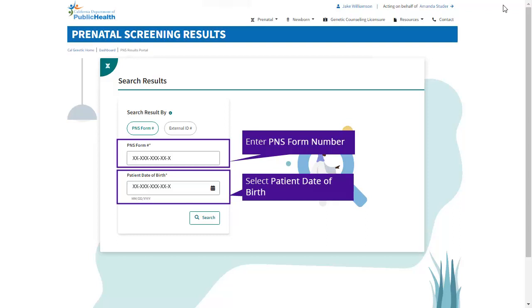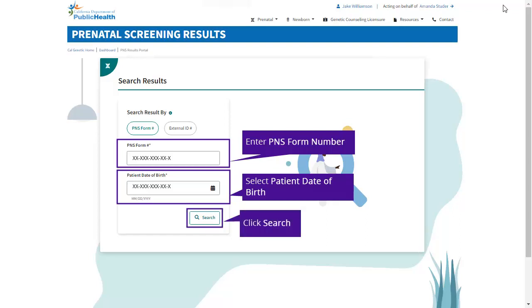You can locate the PNS form number on the Orders Inventory page, previously on the top of TRF. Once entered, click Search to generate results.